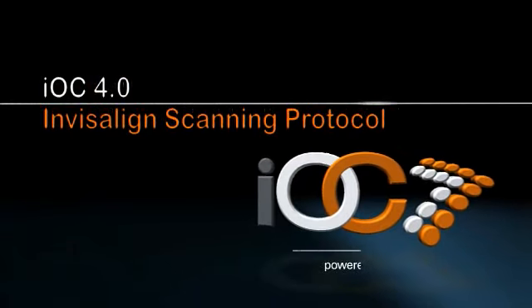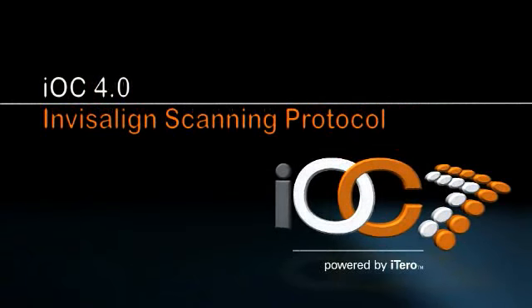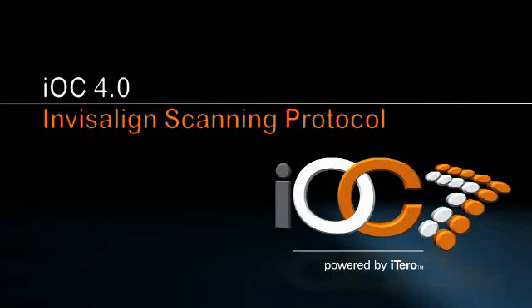iOC 4.0 makes it easy to take scans for providing your patients with Invisalign treatment. Trainer Mike Sabino walks us through the process.